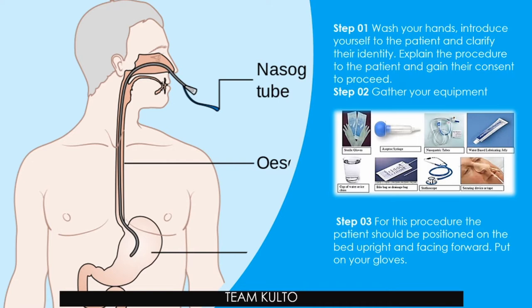Ito, positioning ng pasyente ito. Tandaan mo to. The patient should be positioned on the bed upright and facing forward. Put on your gloves. Upright and facing forward.